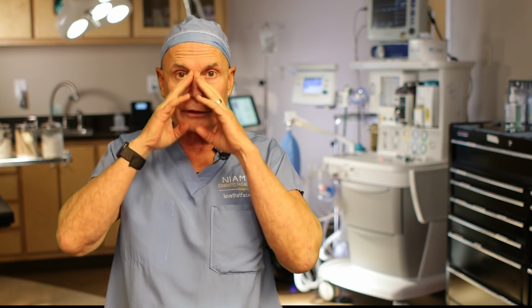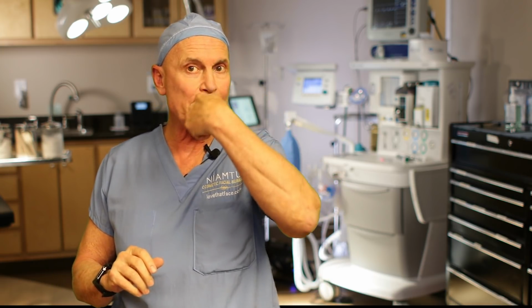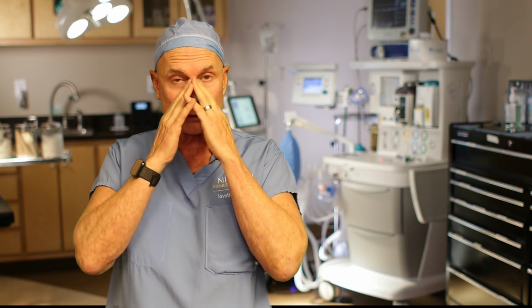So what we do to correct this is we actually have to sculpt this excess tissue. I'm just going to show you some video, and some of you might find it disturbing. We're using a device, the Ellman radio wave surgery, and it's a special wire for Rhinophyma. It's like a cheese wire where you cut a piece of cheese and it cuts the exact depth. We use this to shape and recontour the nasal tissues, and then we follow up immediately with the Syneron Candela CO2 laser for our fine-tuning and sculpting to smooth everything. We literally have to peel off this diseased tissue, almost like sculpting clay.